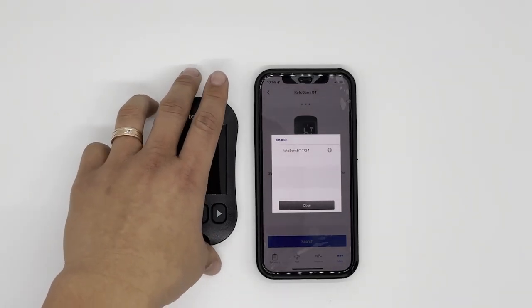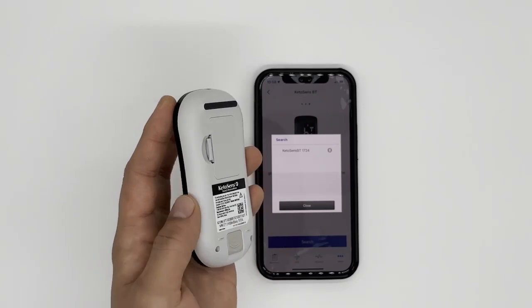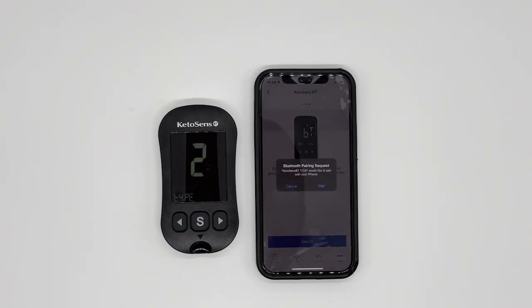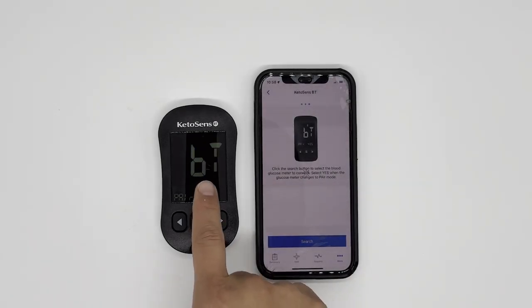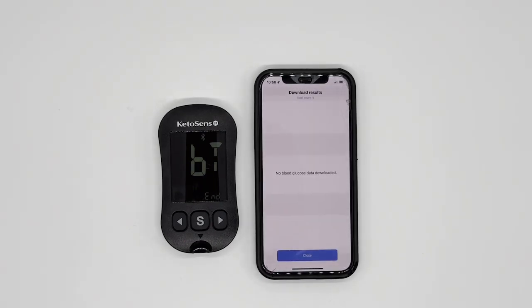The four digits are the last four digits of the serial number on the back of the meter. When you see this, select it. Now, very important step: after you press 'Pair,' you'll see on the meter 'BT Pair Yes' blinking. Here, you have to click the S button to successfully pair. If you didn't do that last step, you have to go back to the beginning of this video, delete from your phone, delete from your app, and redo the process. It is very important to do that final step of clicking the S button.